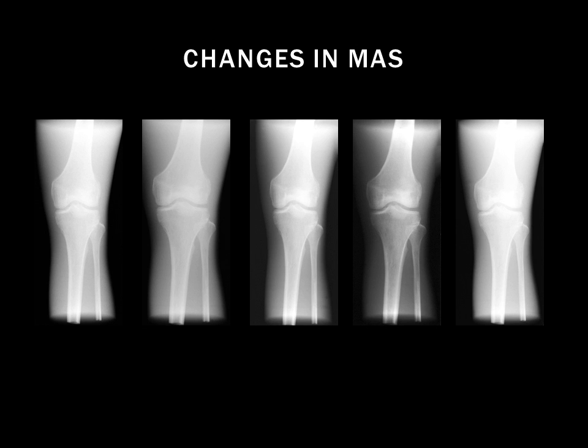In this image, a figure from your book in 26-3, all of these are at 60 kVp with no grid. The first image is at 1 mAs, and we double that for the second one at 2. 4 is in the middle, 8 mAs, and then the very last image all the way to your right is if we took our second image and only decreased it by 20% from B. You'll notice that there's not an extreme difference in those two images.